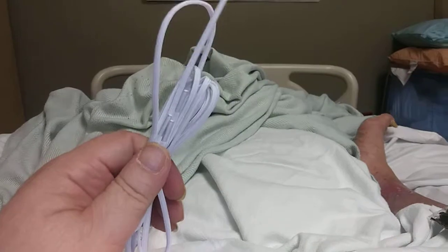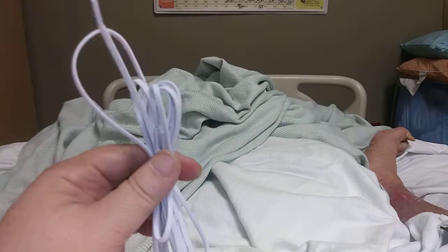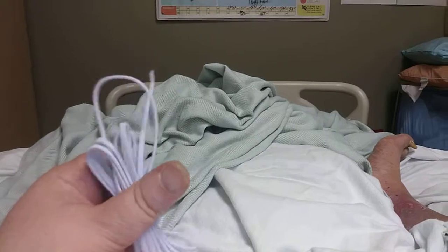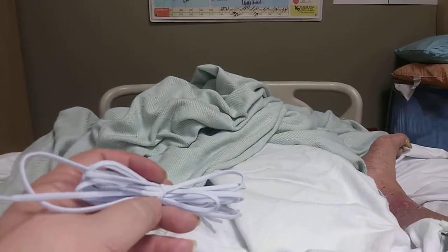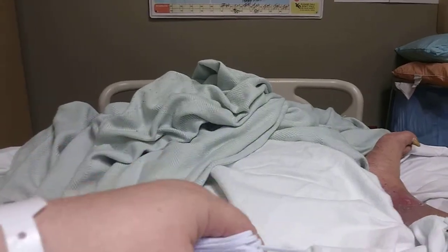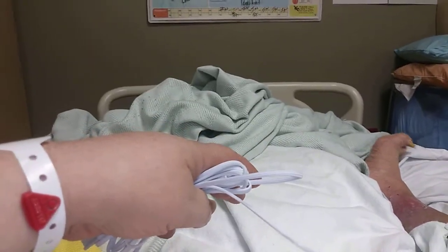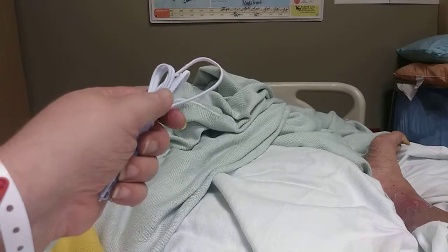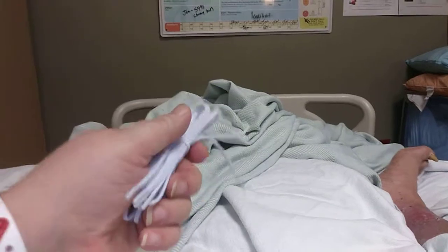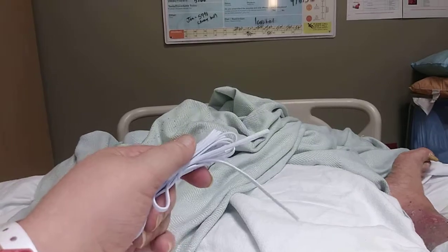And what those are for is so that when you have a hard time putting on your shoes, or you have a hard time tying your shoes, these will make for being able to have your shoes tied already, and then when you go and put your foot in, the shoelaces are elastic, so they stretch, so it won't be so tight on your foot trying to get it in there. Have you ever tried to put your foot in a tight shoe? It's kind of hard. Well, they do make elastic shoelaces. I did not know that. That's pretty neat to have. I like that.